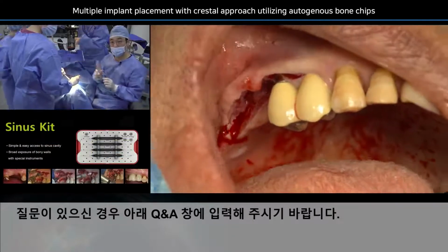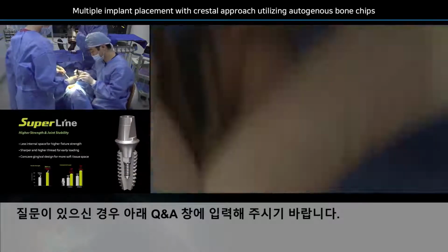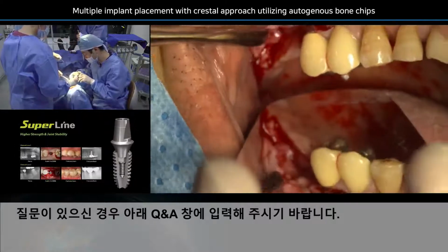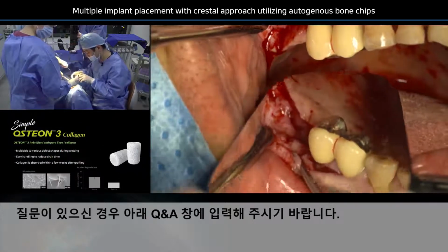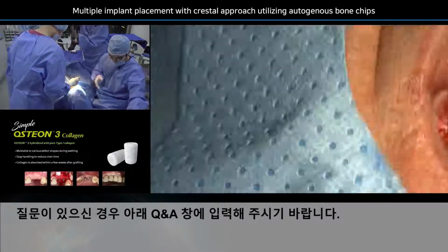And as you can see, I'm using this side view mirror. This is a very easy tool to use because I can see the general idea of the dental arches and the bone area. So, okay, we are missing a lot of bone here today. So use your side views properly and you can get the general ideas.